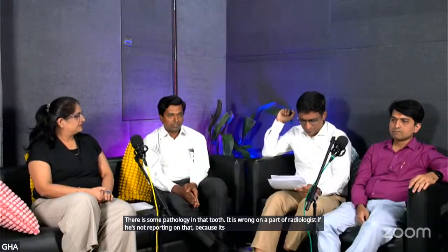Yeah. This is a very relevant question. The doctor has referred for one particular tooth for the scan, but in the scan, the other region is also covered. There is some pathology in that tooth. It is wrong on the part of the radiologist if he is not reporting on that, because it's the overall well-being of the patient, and especially if he has not reported on that, and that has some implication on the patient. Definitely, it is negligence on the part of the radiologist, and it becomes an ethical part on even a practitioner.